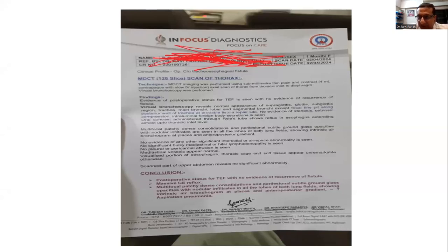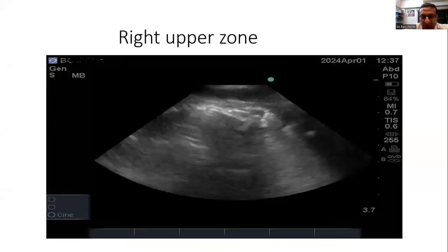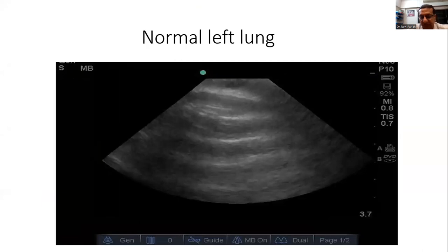Can we go back to your images, because they're very nice. Just to highlight, what we're using here is a curvilinear probe, with very good sector width. You've got good delineation of the pleura, which is visible over here, and then a very nice A profile.